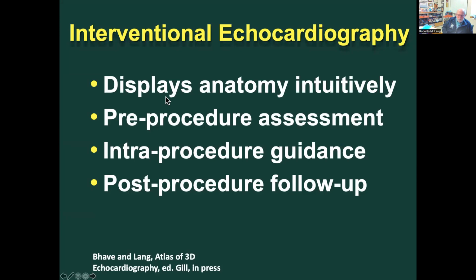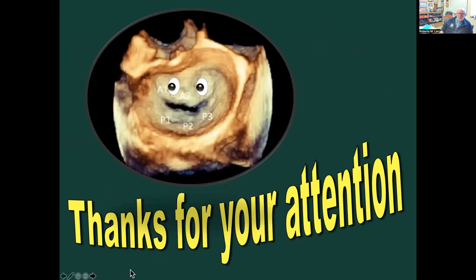So I think, now to finish, is that interventional echocardiography displays the anatomy for you. It allows you to do a pre-procedural assessment. We use it in every case to do guidance inside the procedure, and it's extremely useful for our post-procedural follow-up.